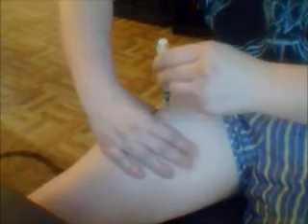And just real easily inject it here. Sometimes it stings, sometimes it doesn't. So it looks like it's in there. Now, once you get it all in there, you just want to let go, and as you let go, pull the needle back up out. And put the cap back on the needle. Set the needle aside. Now, sometimes it'll bleed, sometimes it won't.